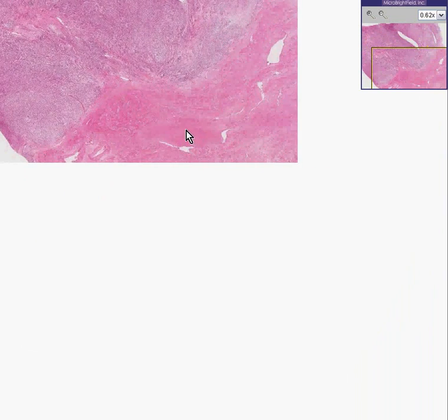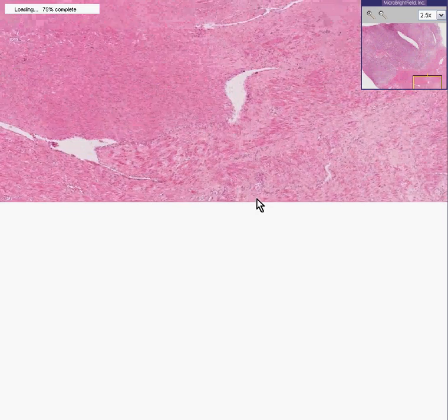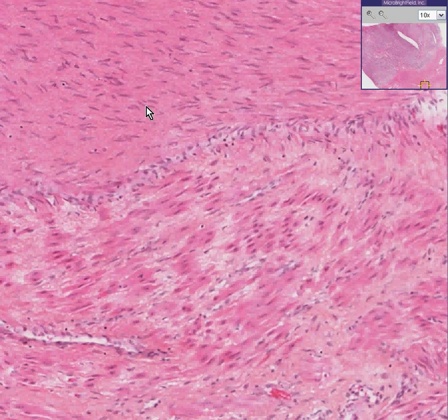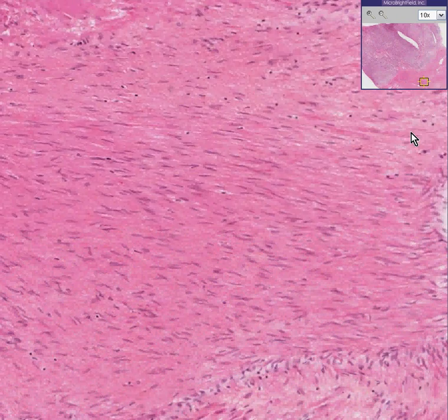First of all, let's study the normal smooth muscle part. Like any other normal smooth muscle, you can see the cells are spindly. If you cut them longitudinally, they look like little cigars. If you cut them transversely, they look like little circles. Notice that whether we study this field or 10 more fields like it, we cannot find very many mitotic figures — perhaps one mitosis per 10 fields. Smooth muscle cells normally do not demonstrate mitosis well in histology.